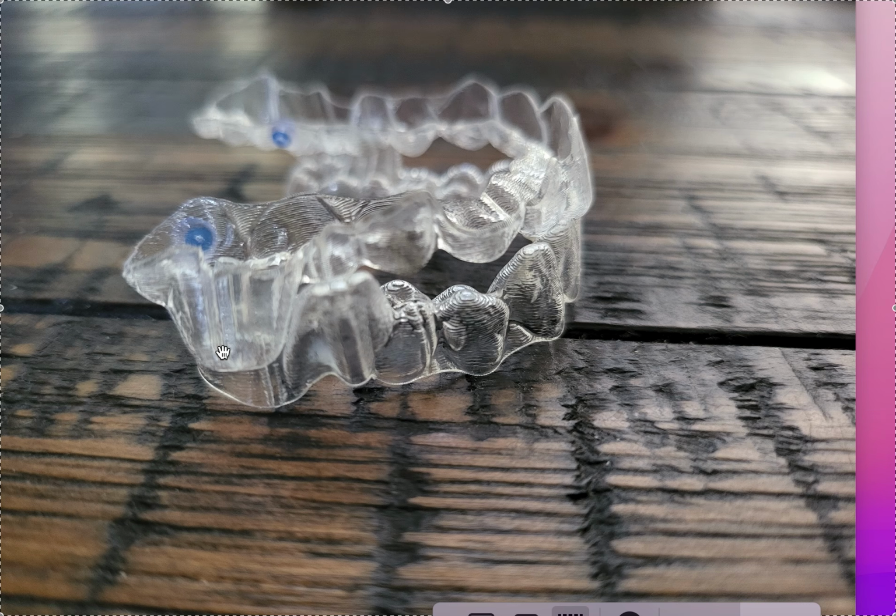Okay, back to the Invisalign with MA. So Invisalign with MA basically takes a page out of how a Bionator or a twin block works, where you're setting the mandible forward 24 hours a day, okay? Not 12 hours a day, not 14 hours a day, not just at night. It has to be sitting forward 24 hours a day. And the pressure of sitting it forward encourages the lower jaw to grow. Now you're gonna have to do this for at least a year, 9 months to 14 months, somewhere in there. It's a long time. This is a marathon, not a sprint.